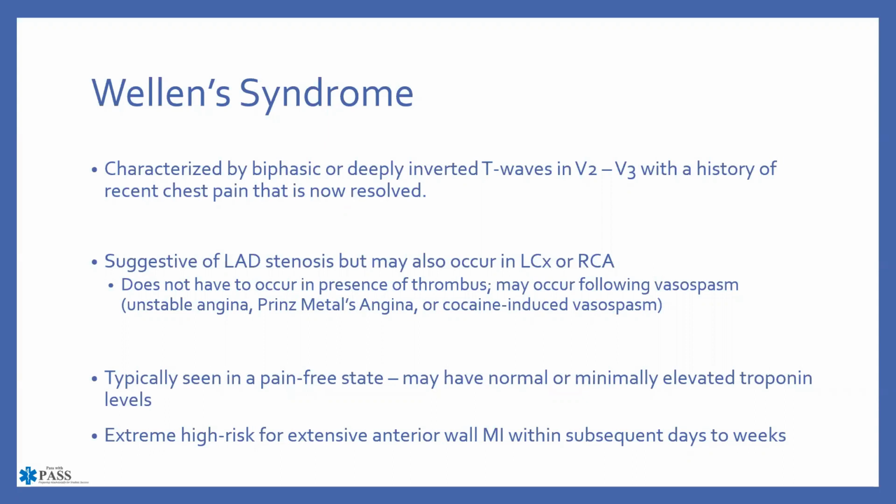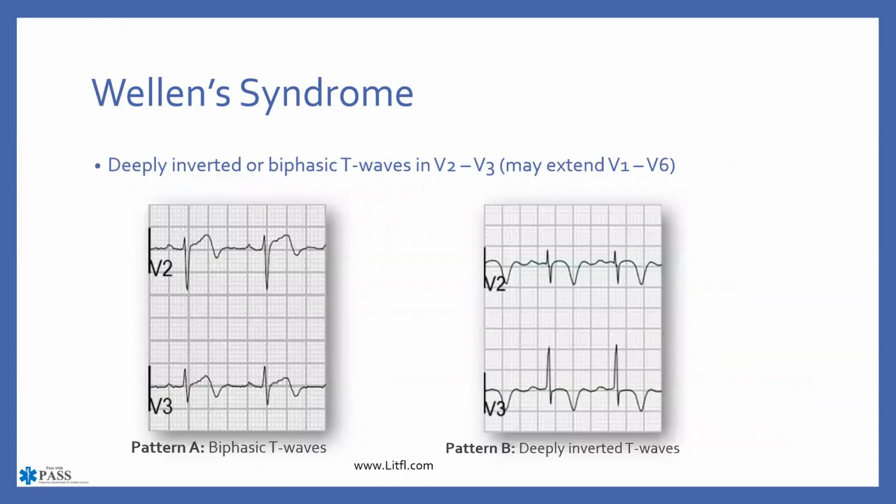And that is where our ST segment elevation comes from, because we did not fix whatever the problem was leading to that occlusion or the ischemia of that part of the heart. So when we look at Wellens syndrome, and we actually look at this EKG here in just a second, I want to point out that you're going to start seeing some of these EKG changes, and they're going to happen live, which is why we should be doing serial repeat EKGs.